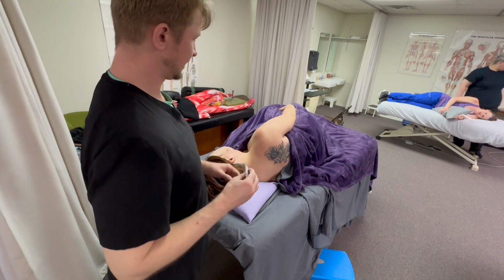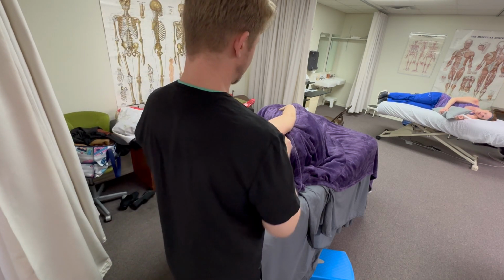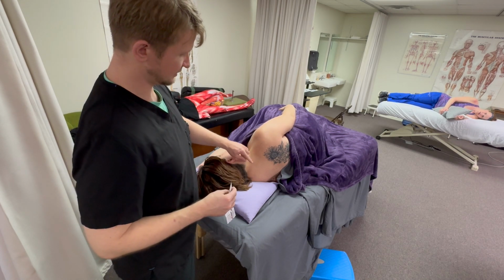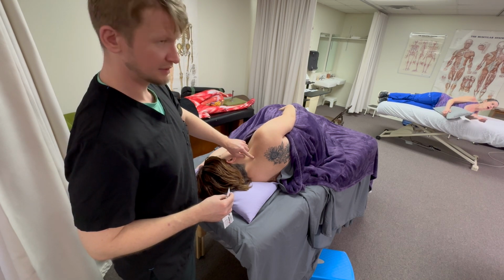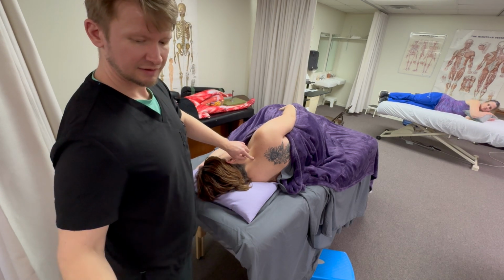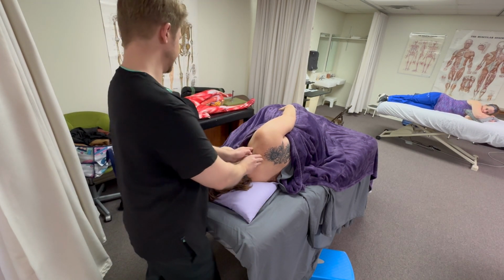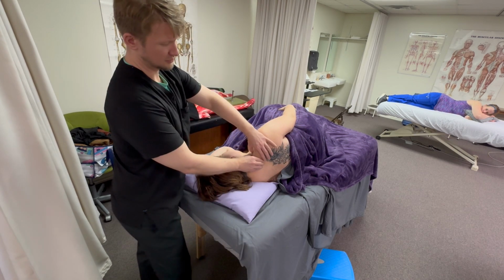So anchor one, I can pick. Here, I'm going to start where I'm limited related to the neck, and so I'm going to at least try to cover a chunk of upper trapezius. Some of this anatomy, it's just kind of over time, you'll learn and feel. Oh yeah, that's sensitive. Okay, good.